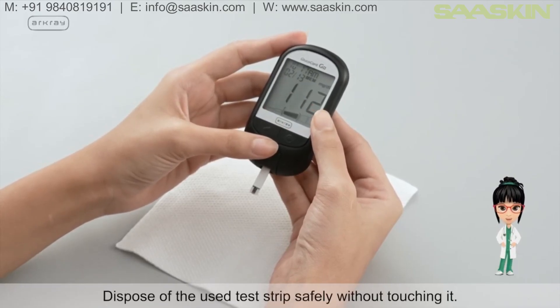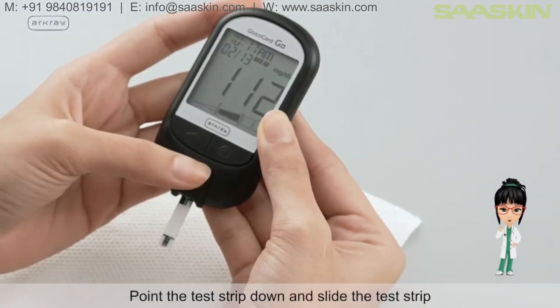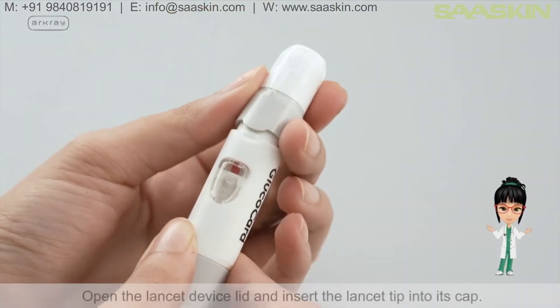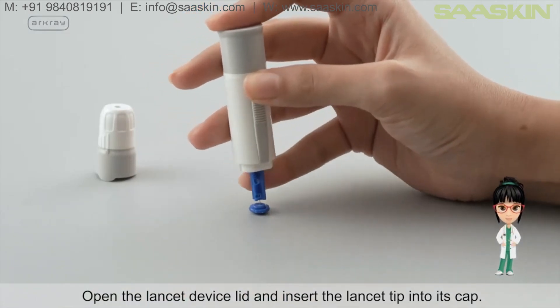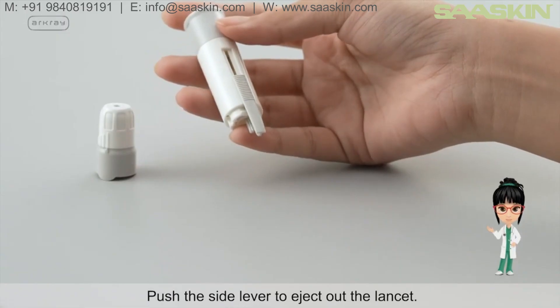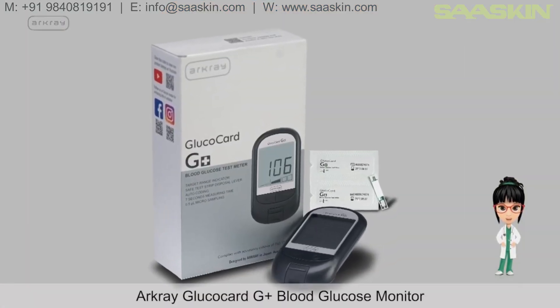Dispose of the used test strip safely without touching it: point the test strip down and slide the test strip disposal lever on the device to eject it. Open the lancet device lid, insert the lancet tip into its cap, and push the side lever to eject out the lancet.